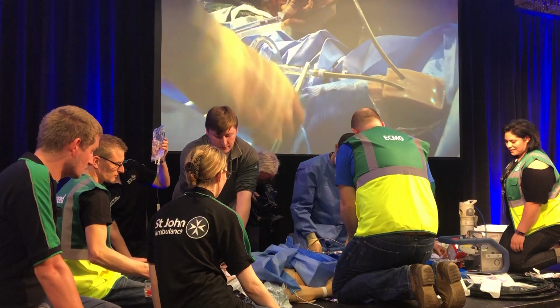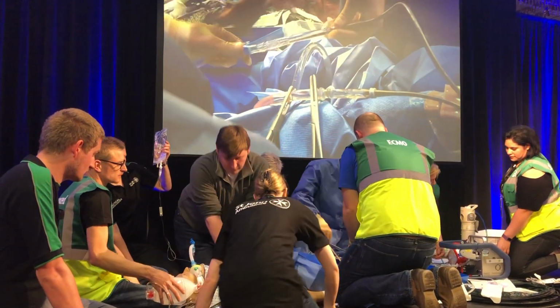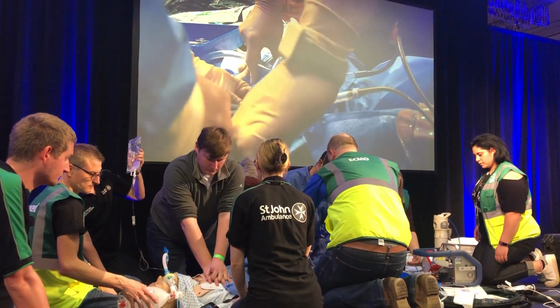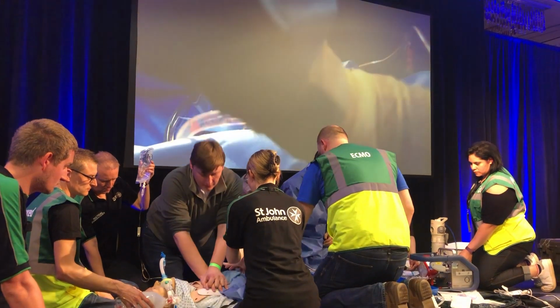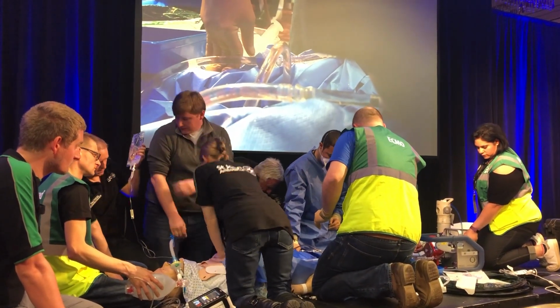Yeah, so tomorrow we'll be using a LUCAS. Again, there's no evidence for mechanical CPR in terms of big studies. There's a million reasons why you might not see that advantage. Actually, anecdotally, it's right by the flow, and we would use mechanical CPR. Okay, so Mamoon's clamps are up, so it's going on.